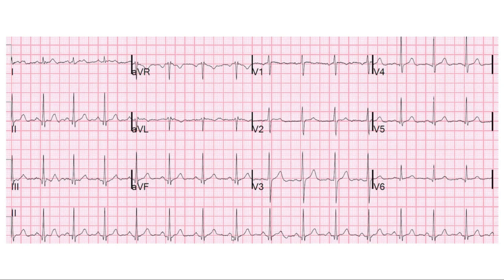The next thing we look for in the ECG is the rate. We can find the rate by counting the large boxes between a QRS complex that lies on a bold line. The first box after this line is counted as 300, the next large box as 150, the third as 100, the fourth as 75, then 60, 50, and 40. So in this case the rate will be between 100 and 75, that is approximately 80 to 85.